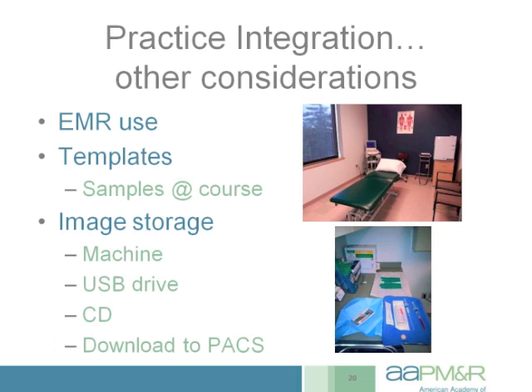Most machines, as well as the machine I have, have the ability to also load those images on a hard CD if you prefer that over a USB. And in some places, you may just be able to connect your machine via cable directly to a hospital or institution PACS system and upload them directly in that regard.